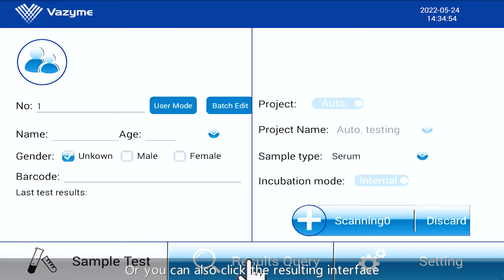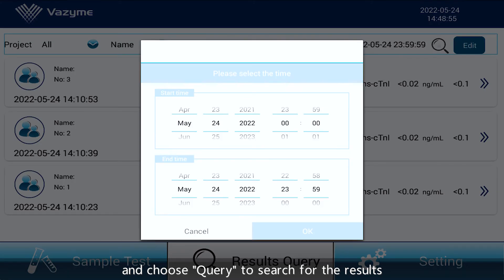Once incubation time is up, the detection result will pop out on the screen. You can also click the resulting interface and choose Query to search for the results.